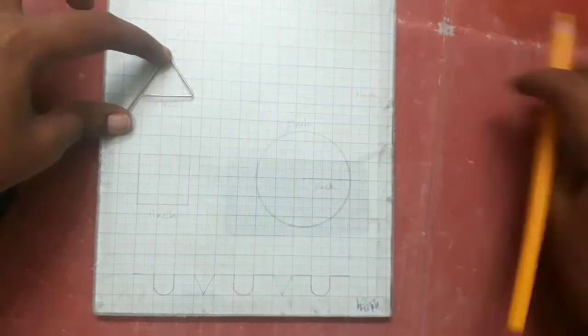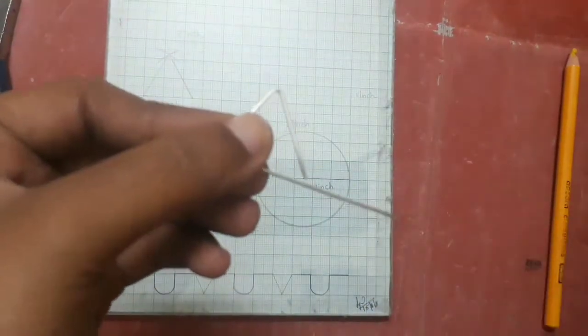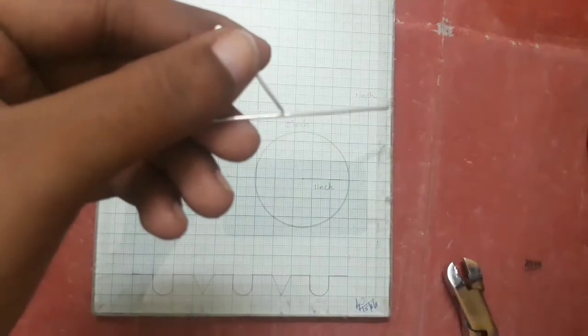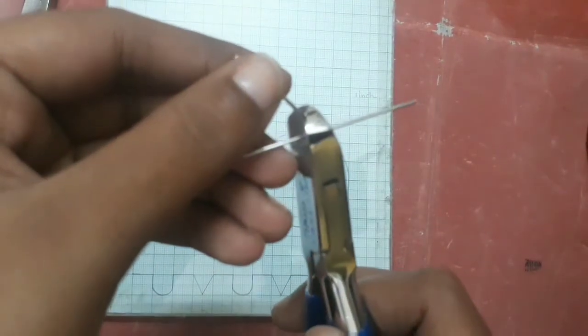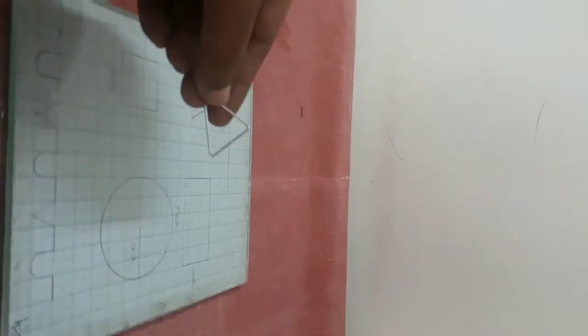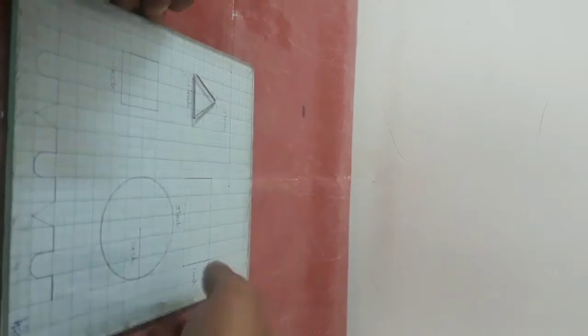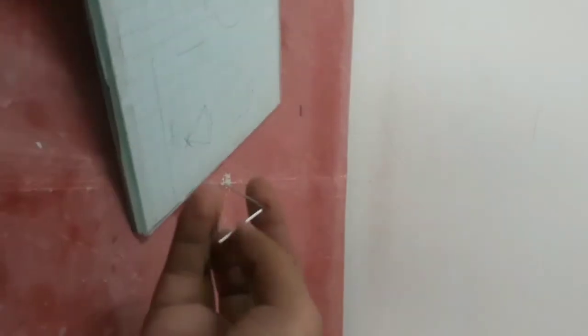When we cut the excess wire, we can cut it. Now, we have made a triangle with an outline. The shape is perfect and the adaptation is perfect. Now let's see how it is adapted.